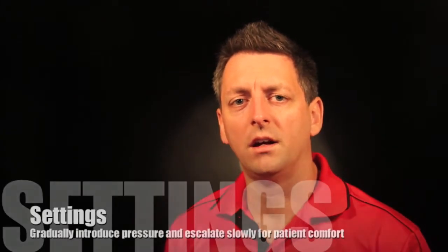Some will work just off air and just use pressure. So if you're out in a rural place and you've only got one oxygen cylinder left but plenty of air, you can still give them air, but it's more advisable if you could get oxygen into them because that's really what they need. Initial settings of non-invasive ventilation to increase compliance.